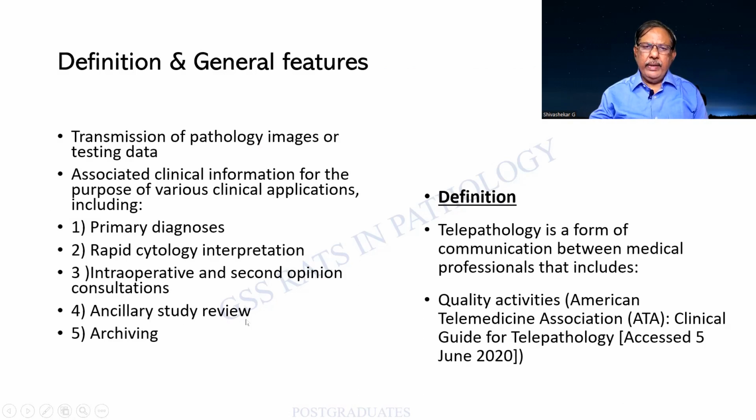Also, there can be an ancillary study review. Finally, it is a mode of archiving or preserving. Nowadays, we have the slides, but the slides fade and we do not have space to preserve them. These could be preserved for n number of years.